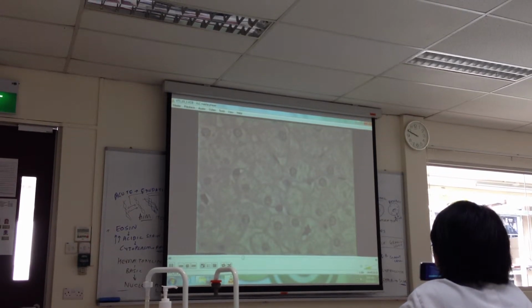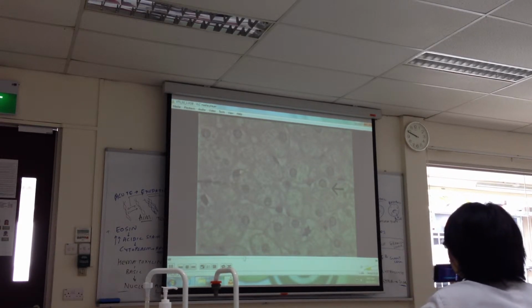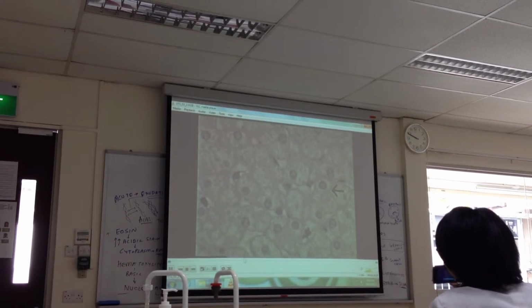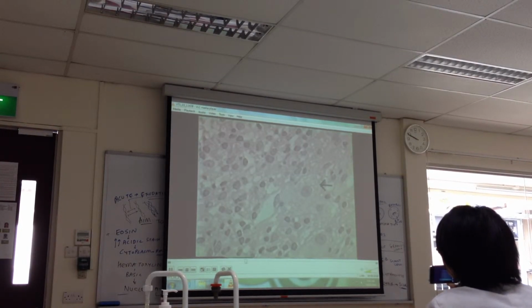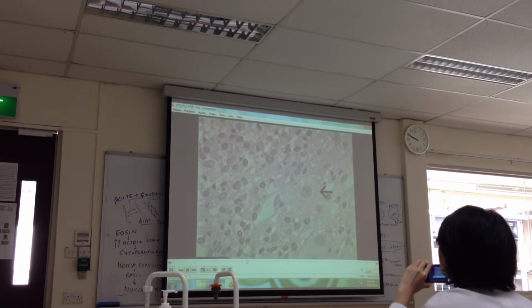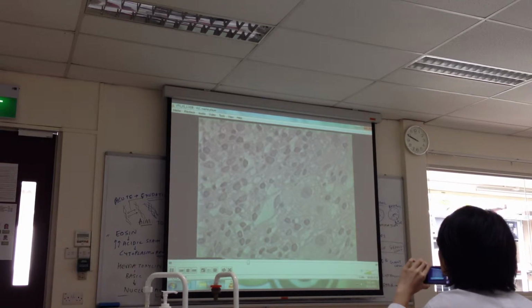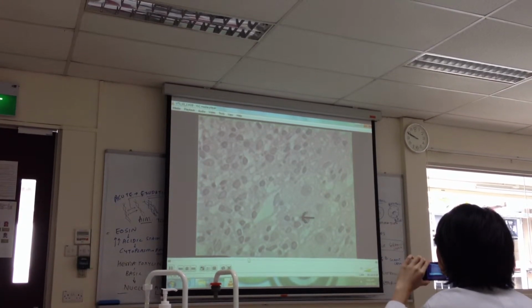Turning to the liver, these are normal hepatocytes. But in this liver, the hepatocytes, such as this one, are swollen. They have been injured by infection with virus. Here are lymphocytes, each with its single, round, dark nucleus.